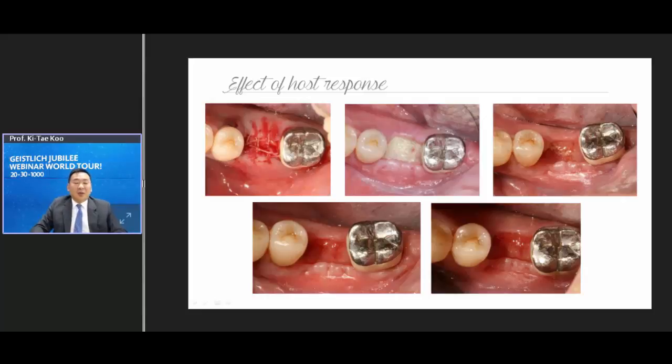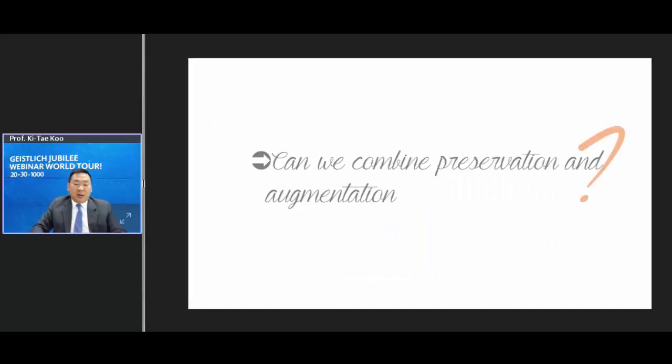So this is the healing we got at 4 months. In the slide next to it, you could see that the healing does start after 2 months, and eventually it healed after a couple of months. So yes, there is a host response effect, but if you use the right biomaterials, I think you are able to overcome this. This is probably the most severe case we saw.